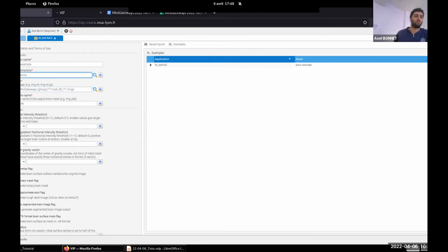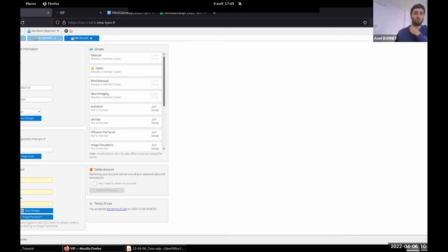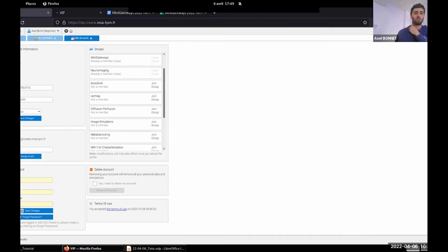Perfect. Can you please, Axel, show us once again how we can join the mini gateways group, because maybe not everyone had an account. So if you're logged in, you can access your account configuration on VIP by clicking on this top left tile. You access the groups list, and you can see here I am already a member of the mini gateways. If it's not the case, you can look for the mini gateways group and join it. And then you have to refresh the browser to let VIP take your change into account.